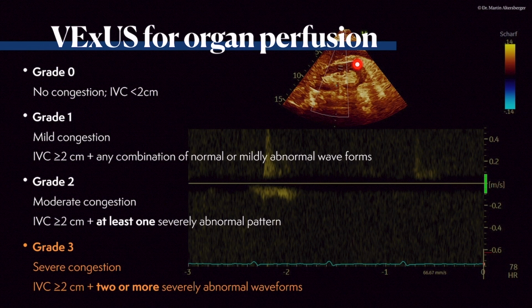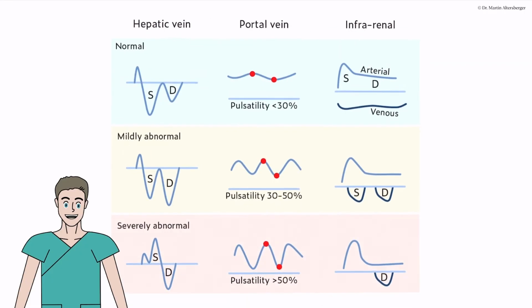Once more, I want to emphasize that the kidney venous signal is not easy to get. Here you have, for example, one arterial signal and here a little bit of a venous signal of the kidneys, which shows also 2 waves, but very often it's not an optimal signal. So keep in mind to find one signal you trust and measure it over and over again to get more experience, to really be used to what you are seeing.